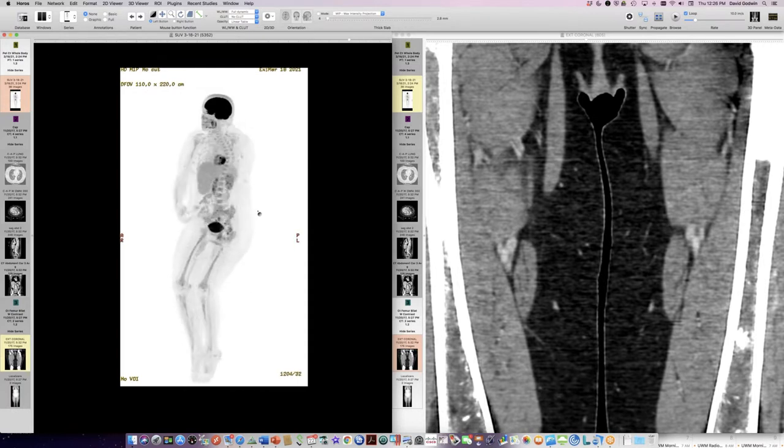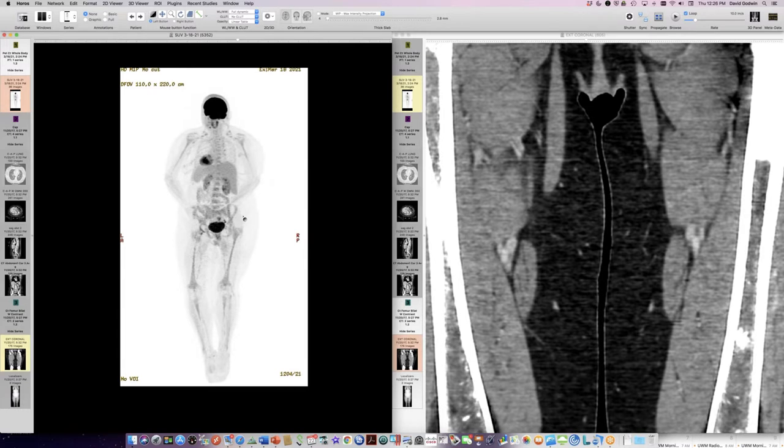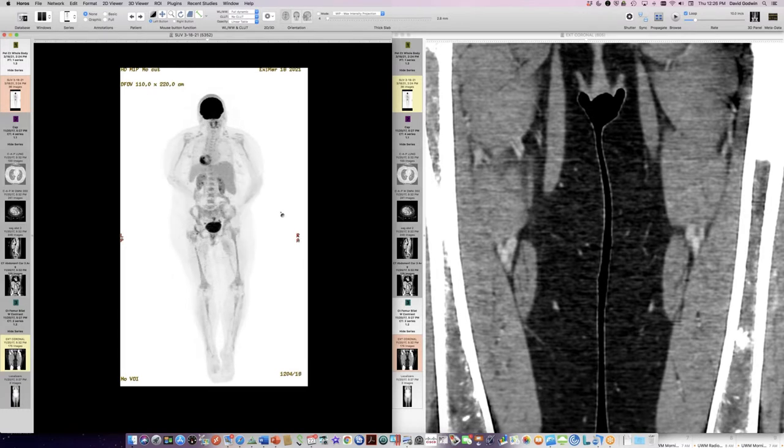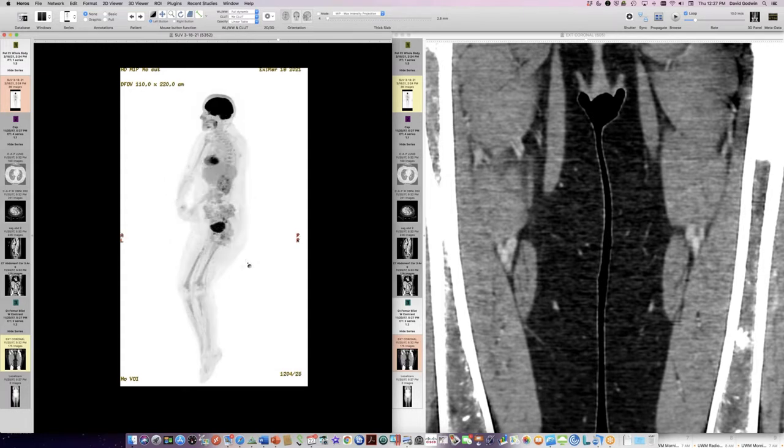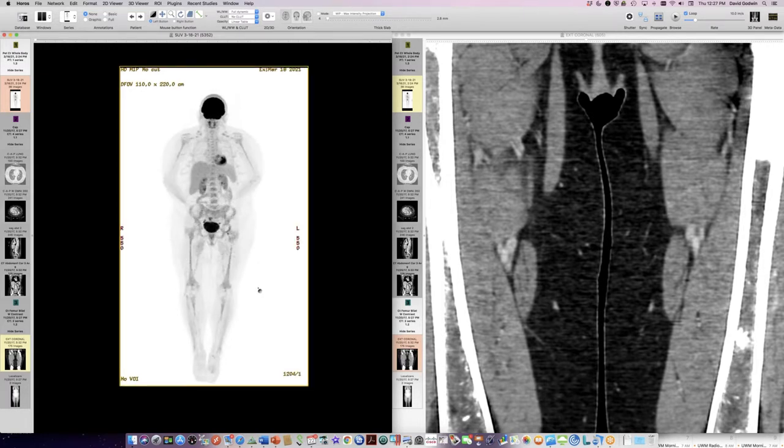So this is Erdheim-Chester disease. Wow. The bone marrow was biopsied, the sacrum was biopsied, a spine lesion was biopsied, and they did not find histiocytes in that. So those might be inactive lesions that had burned out and were just left with bone sclerosis. The person was anemic, so it's possible that the marrow was just very stimulated, and that's why the marrow is lighting up everywhere on the PET scan. And the diagnosis was made from finding the characteristic mutation in peripheral blood, the classic mutation that goes with Erdheim-Chester in the BRAF pathway.